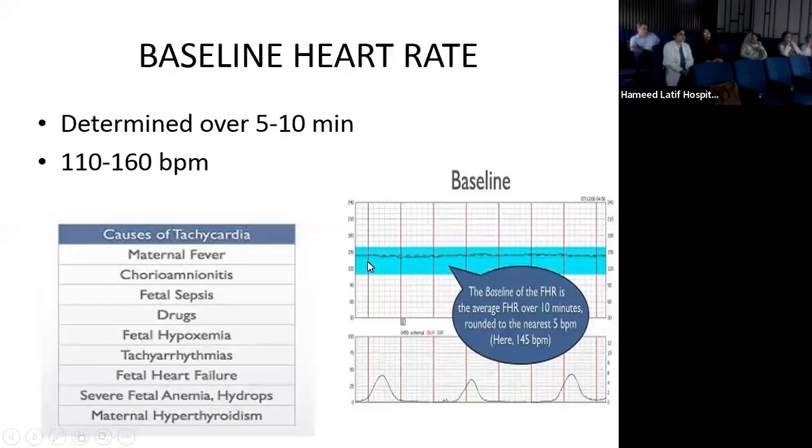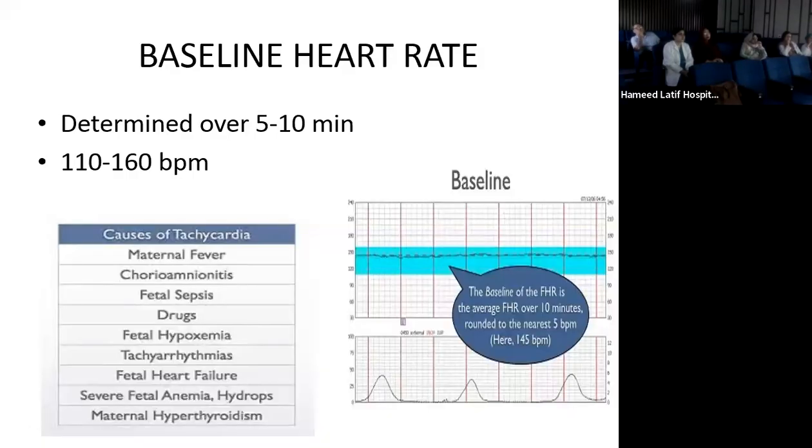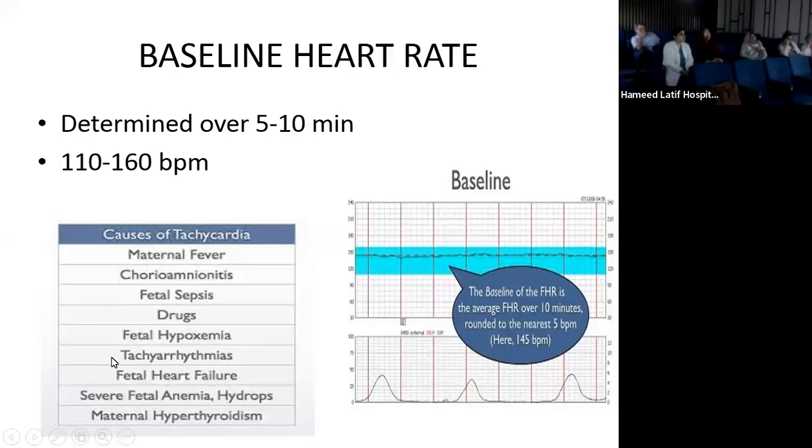This diagram shows the baseline of the fetal heart. It's the baseline cardiac activity of a fetal heart. The various causes of tachycardia include maternal fever, chorioamnionitis, fetal sepsis, drugs, fetal hypoxemia, tachyarrhythmias, fetal heart failure, etc.